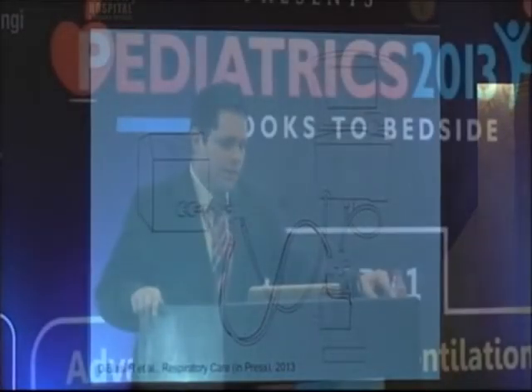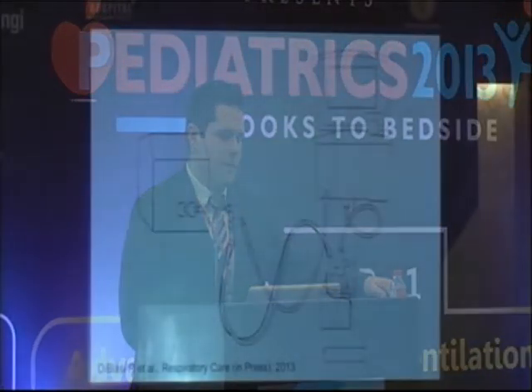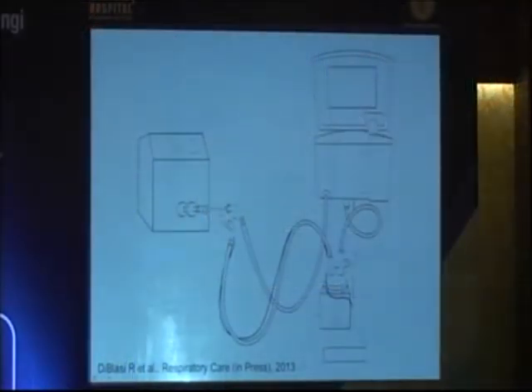Now I'd like to focus on different drugs, and I talked about the pressurized metered dose inhaler with a spacer. In my laboratory right now, we are intensely focused on trying to understand a little bit better how different types of wet nebulizers deliver drug using different positions. For years, we always thought that we would put the nebulizer back at the humidifier in the inspiratory limb, or maybe we'd put it at the proximal airway. Maybe we wouldn't use it at all. And so everyone had their own way of going about it.